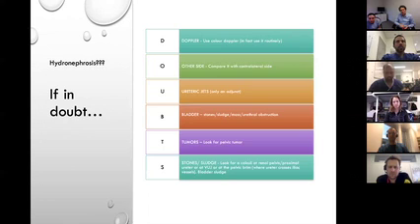I need to warn you about ureteric jets. Anyway, we'll come down to that. It will actually help you a little bit, but you can't take it as the be-all and end-all. Ureteric jets are... all right.